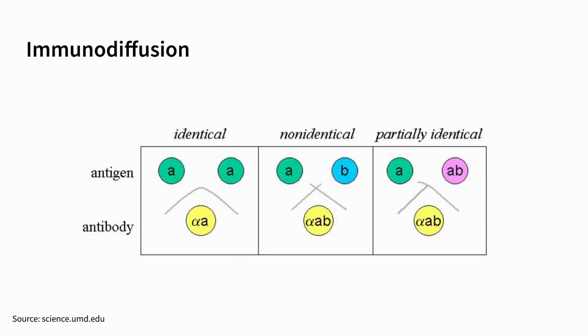Versus if we have a positive control that's showing banding, and then we have patient banding, we can see that line from antigen and antibody binding, then again, there's a high likelihood that that patient has a fungal infection. The antibodies in the test come from the patient sample. So the antigen is added, the patient sample is added, and if there's binding between the patient sample and the antigen, then there's a high likelihood that that patient has antibodies against this pathogen. And the way that the patient gets the antibodies in their serum is by having an infection from these pathogenic fungi.